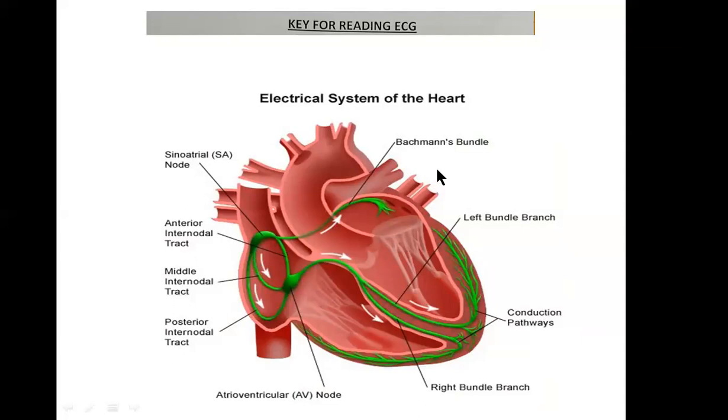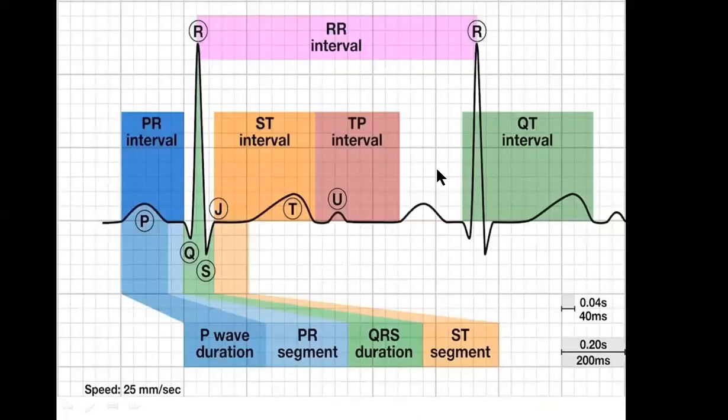So if you see the ECG tracing, it will be like this. The ECG is all about this QRST complex.